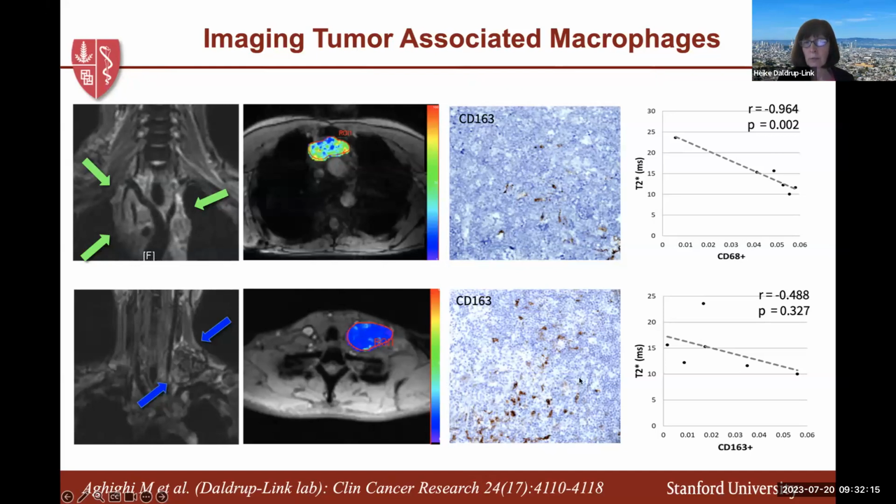And this was also reflected by macrophage stains. You see more macrophages in this tumor here as opposed to the upper tumor.